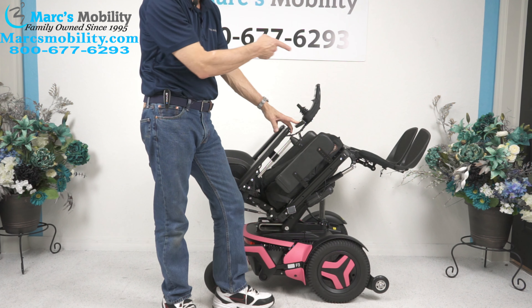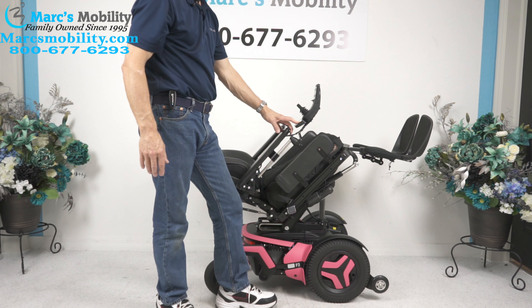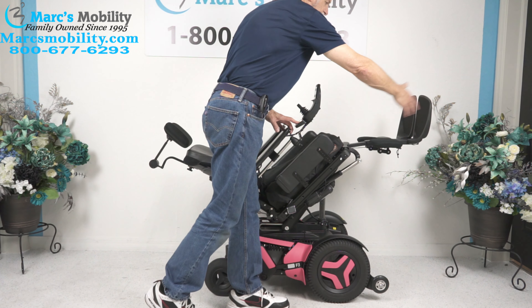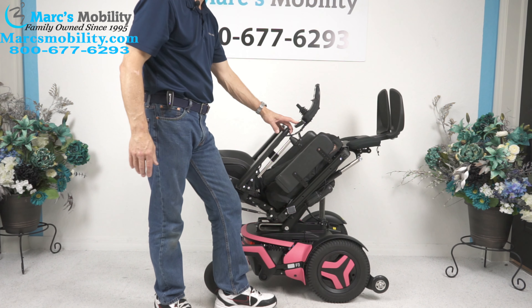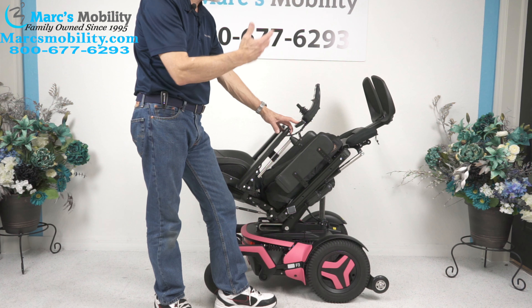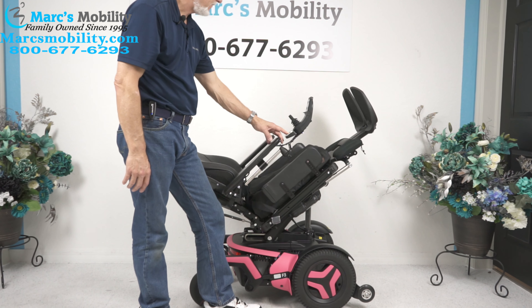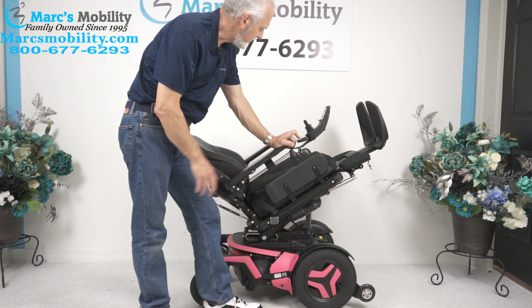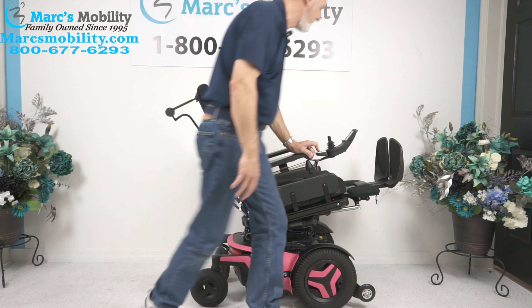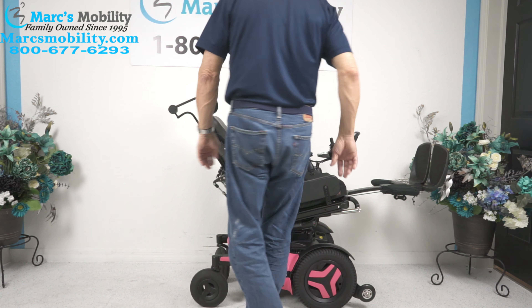The next option is called the electric legs. You can see them going up right now. If you needed some really good circulation, this would be great — and these are adjustable. We can adjust the length of these legs whether you're five feet tall or six foot three. You could be halfway tilted — I'm going to do halfway tilted here just to show you — and your feet will still be high, higher than your body.